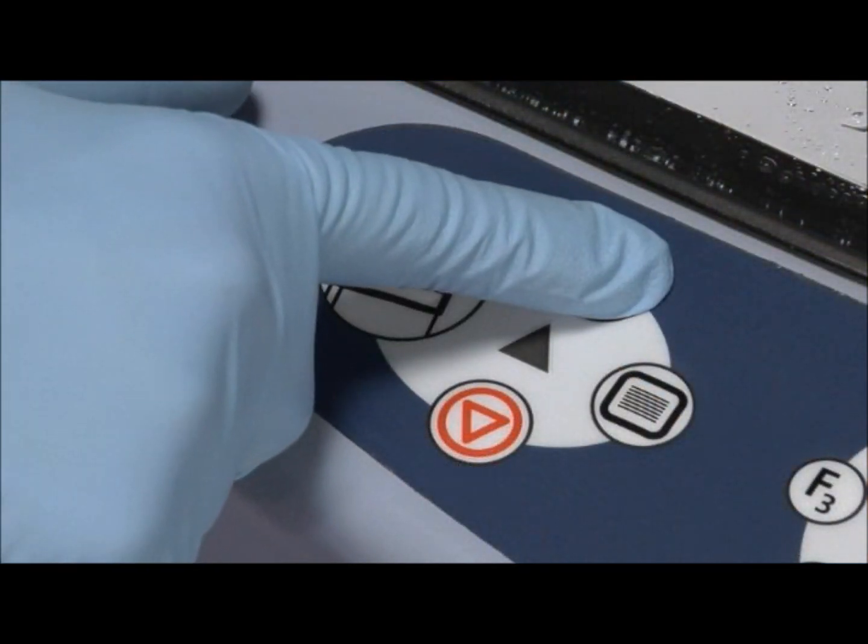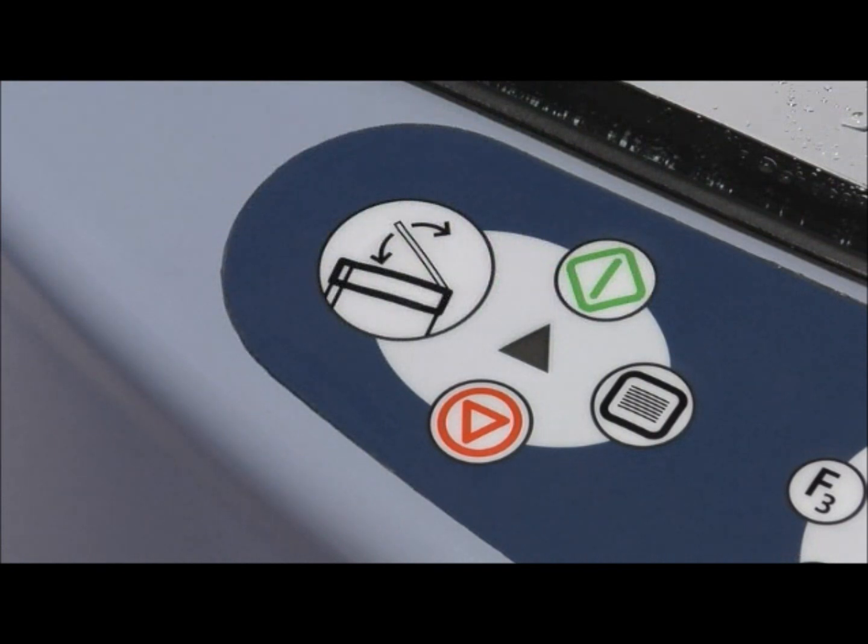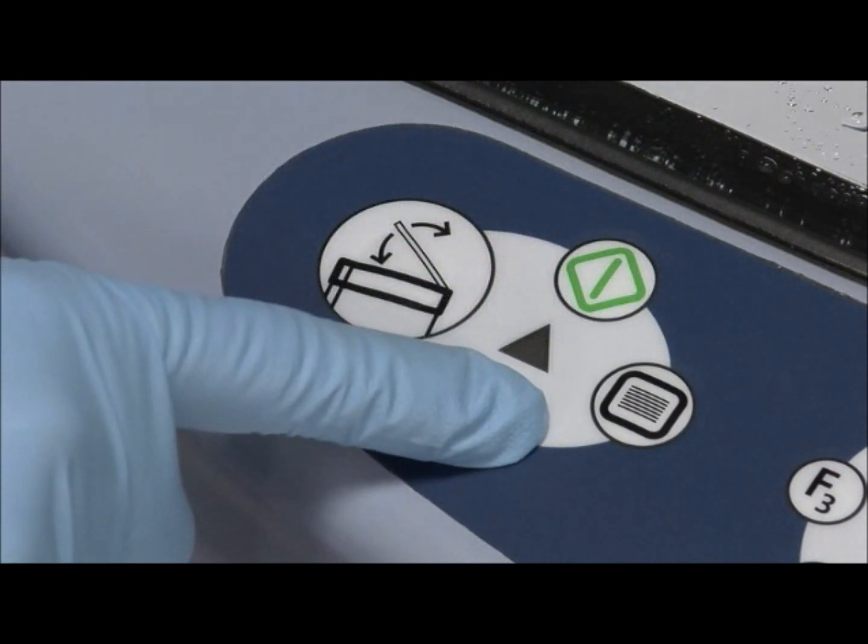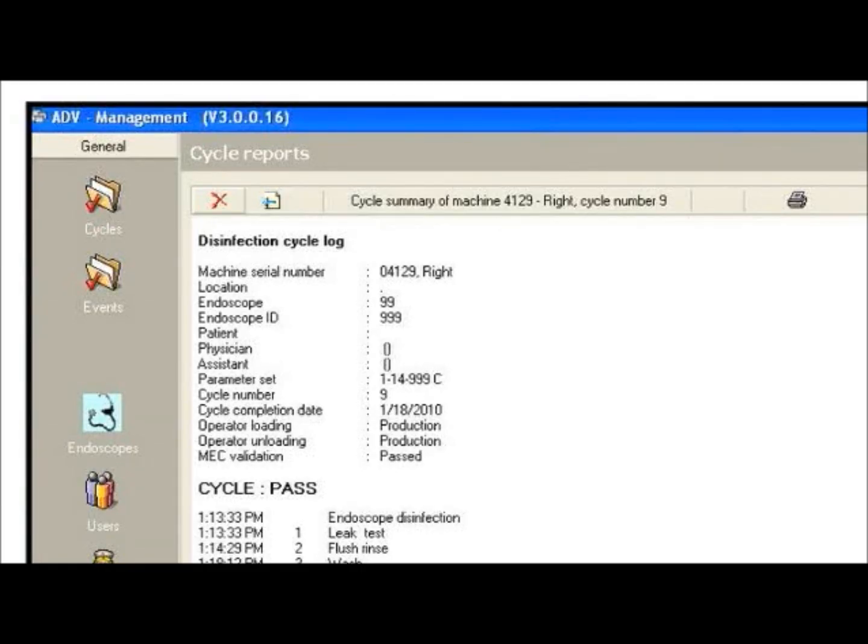Indicate a pass by pressing the start button or a fail by pressing the cancel button. The Advantage Plus will automatically store a record of the cycle, including all the ID data, cycle complete message with test strip pass or fail, and any error messages.